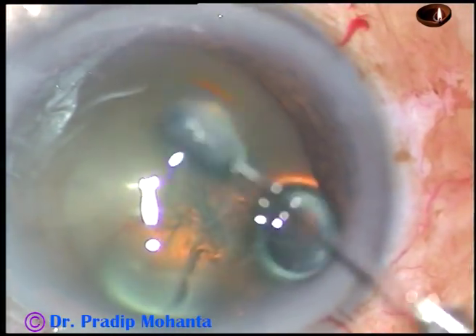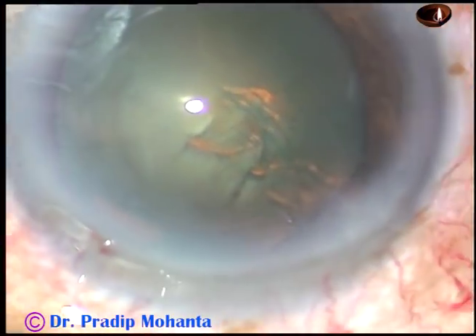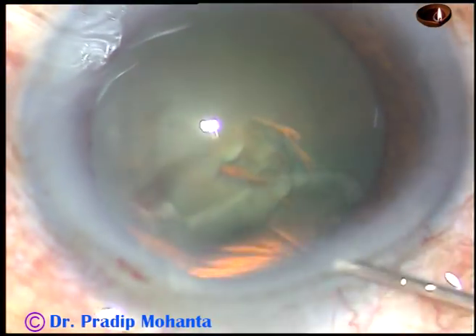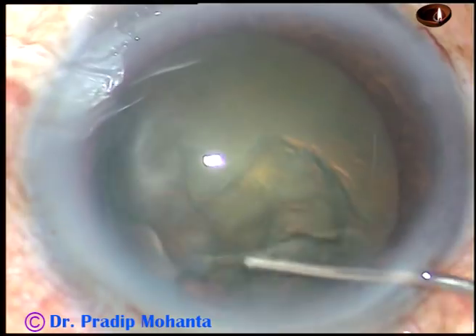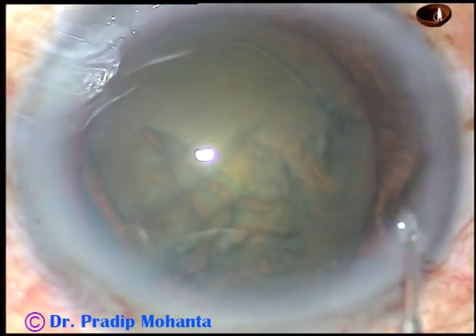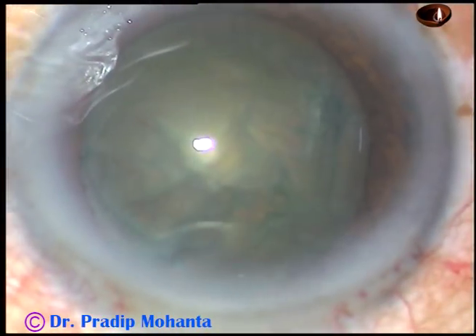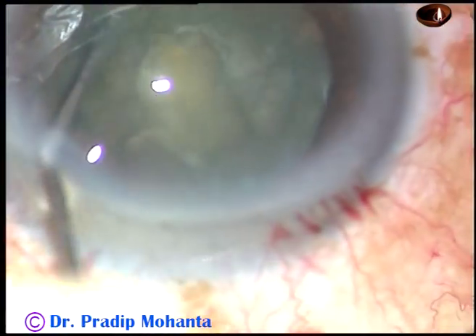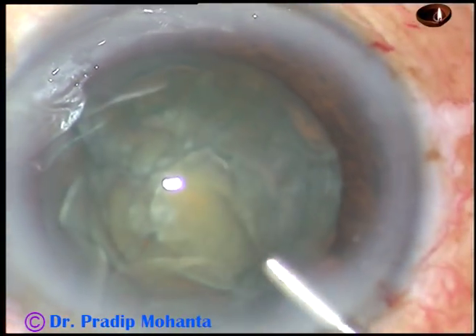And now, hydrodissection. Pass a fluid wave just under the anterior capsular rim and see how it goes to the opposite side. You can see the fluid wave goes to the opposite equator. Depress the opposite equator and you will see that the fluid wave is coming anteriorly along the equator. Mobilize the nucleus, rotate the nucleus. While you rotate, keep injecting BSS — the anterior chamber will remain formed.